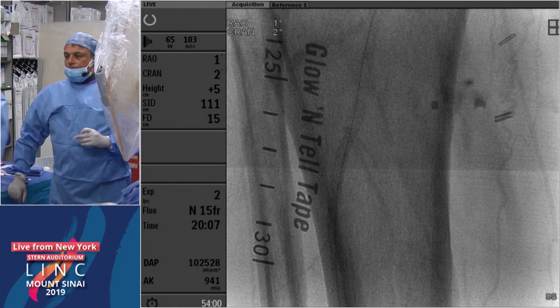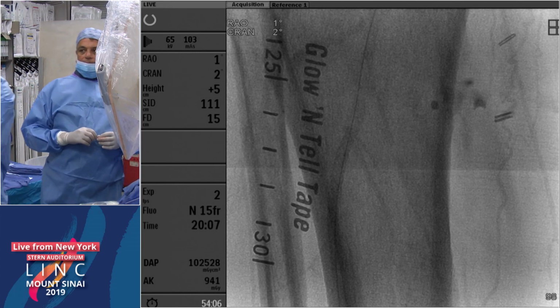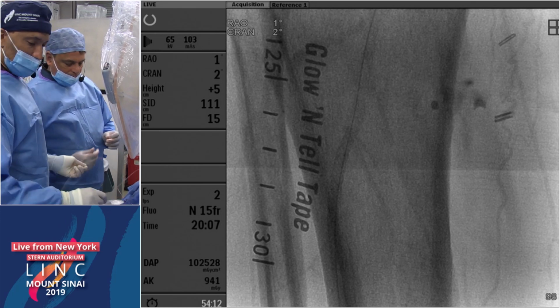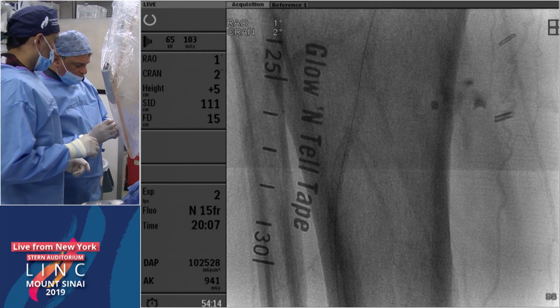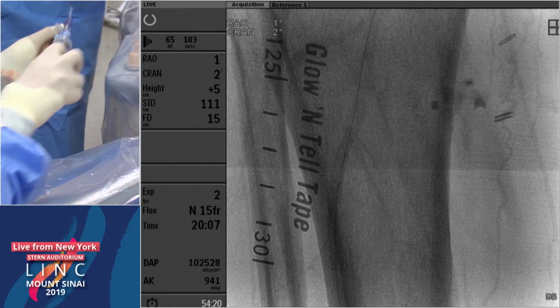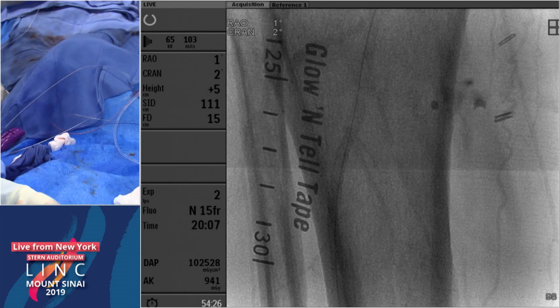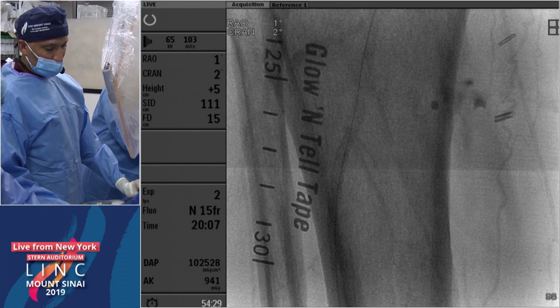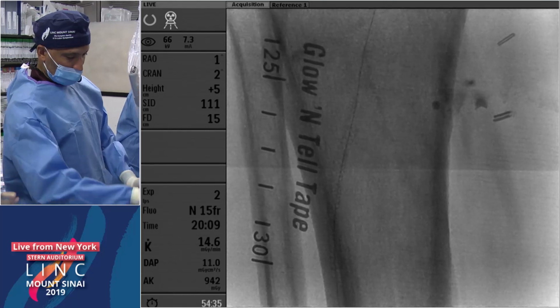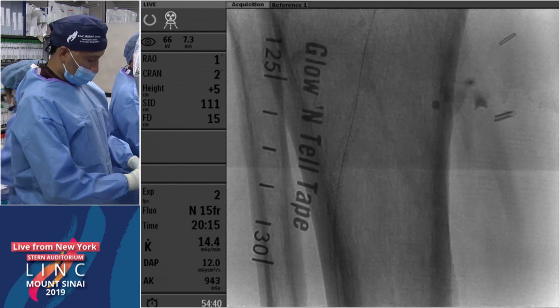I guess the only caveat is that, as surgeons, we often encounter patients who have had their above-knee SFA and popliteal stented, and when those go down, they go from being above-knee candidates to below-knee bypass candidates, and that certainly impacts patency, at least with PTFE. And we worry about the same with tibials. As tibial stenting has been more adopted in recent years, I'm seeing patients with half of their tibials lined with a series of DES devices that could potentially impact their ability to maintain long-term limb salvage, because these tibials are the last line of defense. They're the last target we have for bypass. So that just has to always be kept in mind.